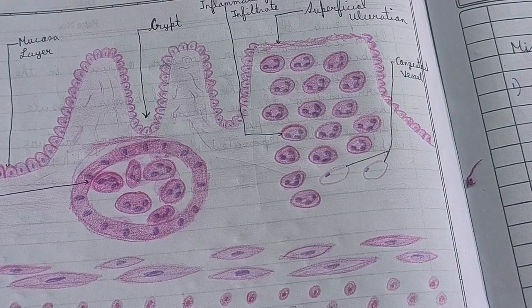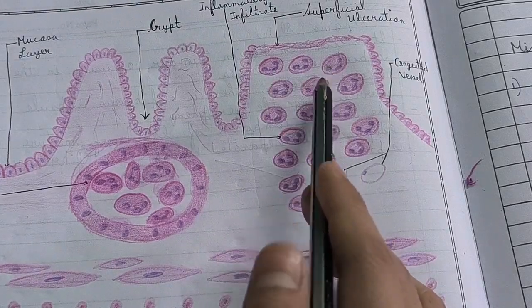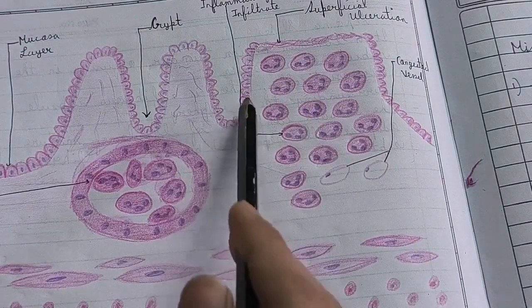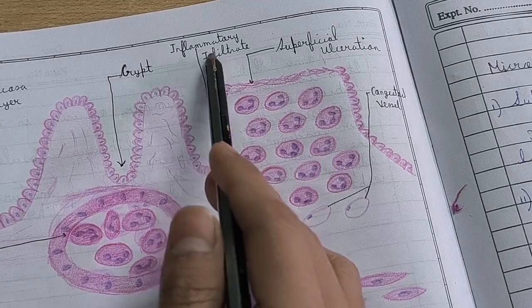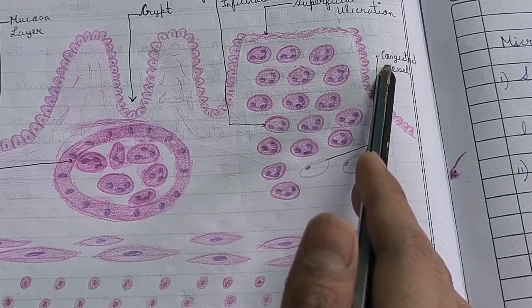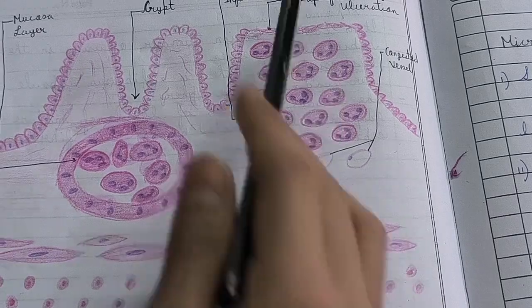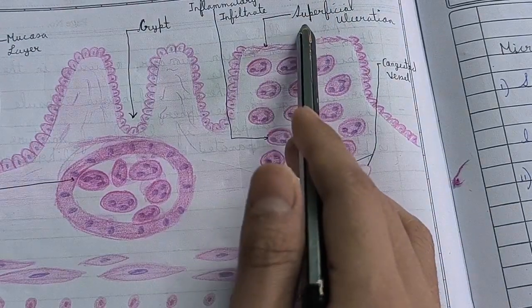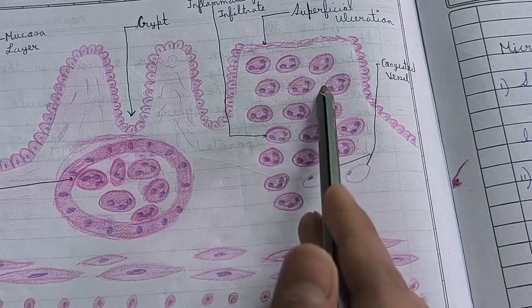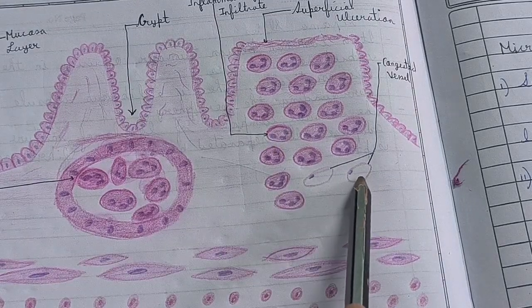Normally neutrophils have 2 to 5 lobes, and in this case 3 lobes also. So these are neutrophils, and neutrophils are present in the ulcer region. These act as inflammatory infiltrates. You can also see that congested blood vessels are present in the ulcer region. So that is all about the ulcer region. The first thing is that it is superficial ulceration, and also in this ulcer region neutrophils are present and act as inflammatory infiltrate cells, and congested blood vessels are found.